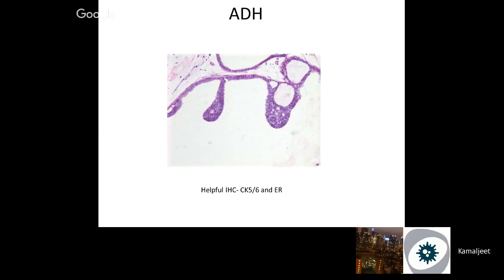There are a bunch of patterns you can see in ADH. One of them is micropapillary, which in this picture is very obvious, or I would say overt, but they can be subtle, like what you see in gynecomastia, and we will look at the picture later. In a micropapillary architecture, what you want to see is a narrow base, like a club shape, and the size of the nuclei at the top is almost the same as at the bottom. So that would make it micropapillary type ADH.